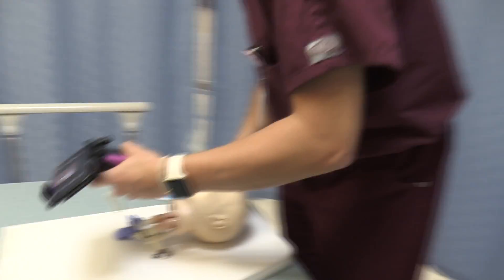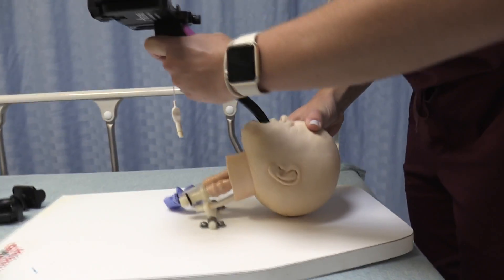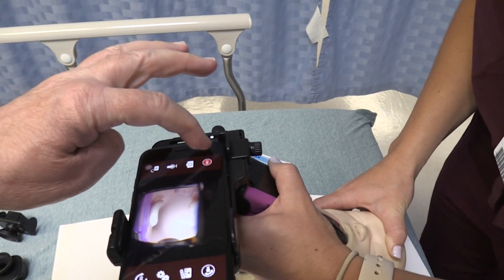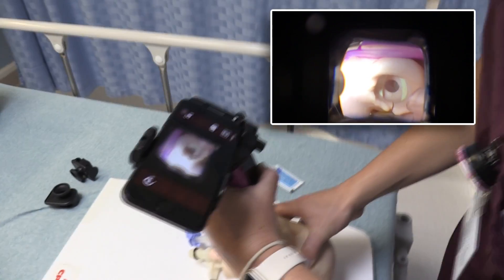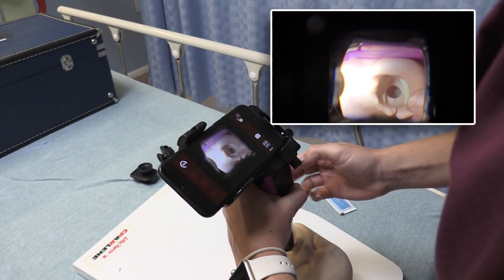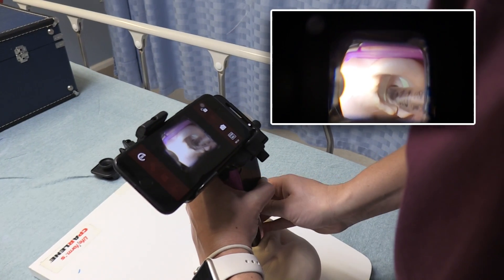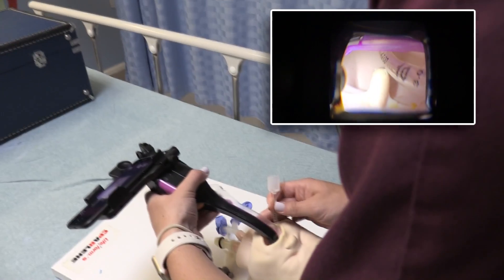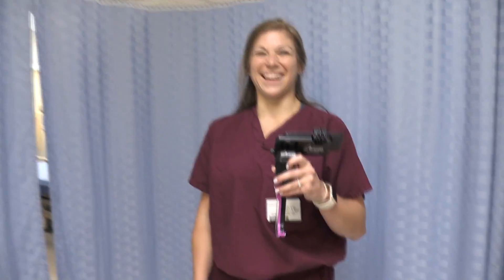I'm going to watch at the mouth to make sure I'm not injuring the tongue or blocking the airway. Now I'm watching the camera screen — you can see the vocal cords and the tip of the endotracheal tube. I'll use my right hand to press it forward into the airway, then peel away the endotracheal tube as I pull back on the AirTrack. There you go — like a pro!